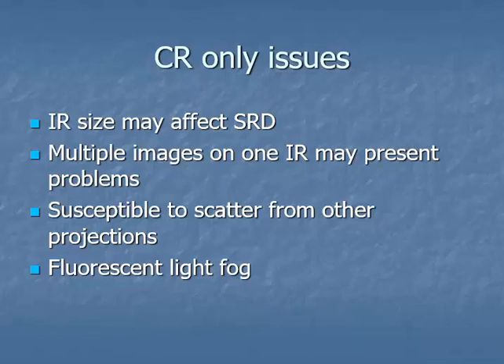So if you change that image receptor size to a 14 by 17, and you've got that same matrix size, 1,000 by 800, then what has to happen in order to fill up that new, larger image receptor is those individual phosphors have to be larger. As a result, you have less sharpness of recorded detail, lower resolution with larger image receptors.